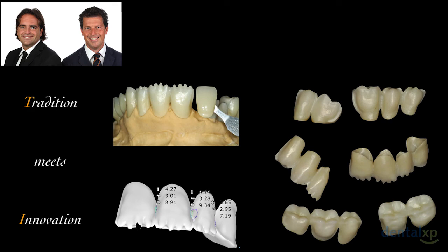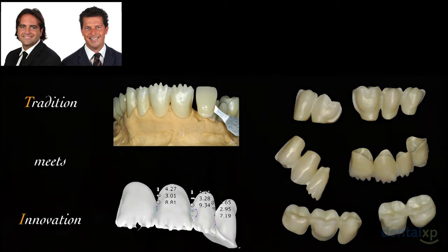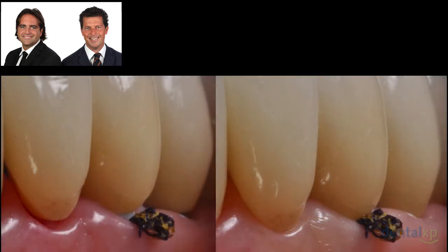So we need them, because we want to have the best looking final prosthesis possible. And by doing this, we are fulfilling the patient's request. So cementation is the final step of the treatment plan sequence, but it must not be underestimated. It's crucial.